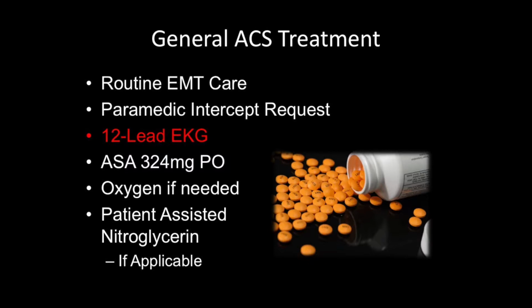So out of this whole thing, really, the 12-lead is the only thing that we're not doing yet. We already are doing this, we're already doing this. We're already assisting with nitro, right? All of that we're doing, we're just adding 12-lead, okay?